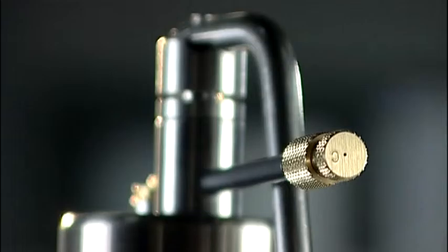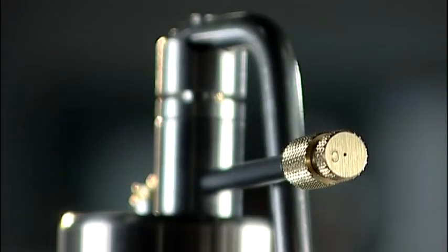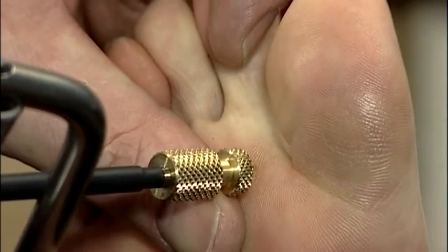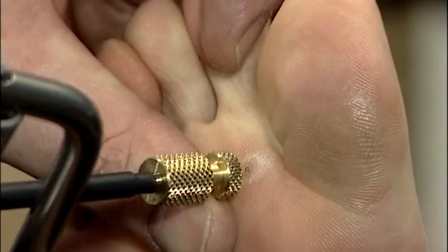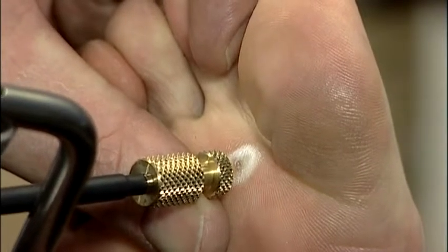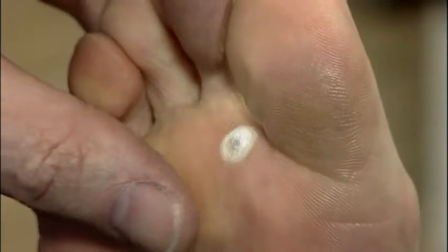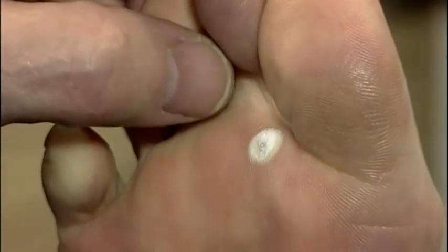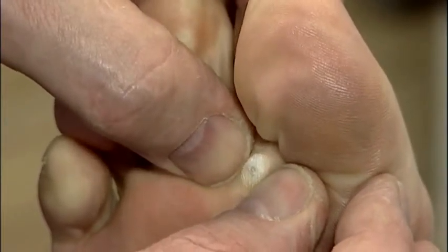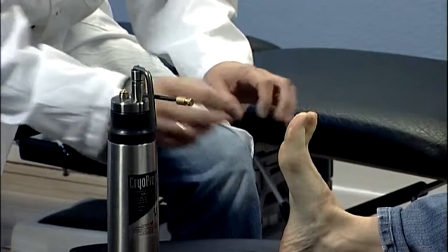As standard, a CryoPro unit comes with a set of 6 spray tips covering a majority of applications. The apertures vary in size from A through D, D putting out the smallest amount of fluid. Simply choose a size which will freeze the lesion as quickly as possible, at the same time offering good control over the spray and minimal damage to healthy skin surrounding the lesion. Spray freezing offers quick and efficient freezing with minimal preparation of the site to be treated and no cleaning of the tip, as there is no skin contact. Attention to the lateral spreading is necessary.